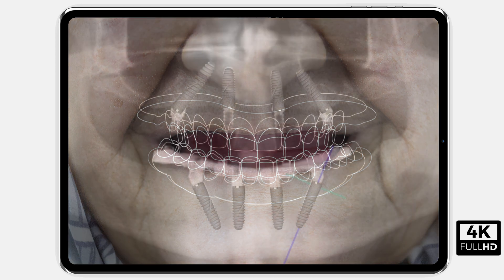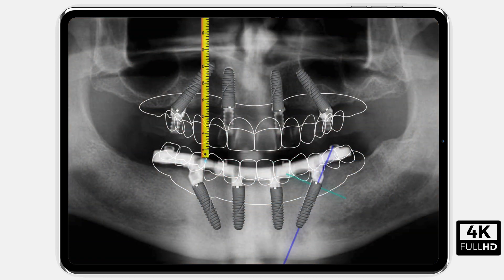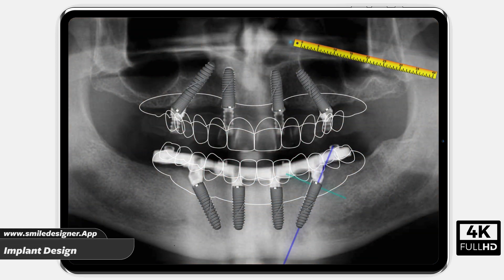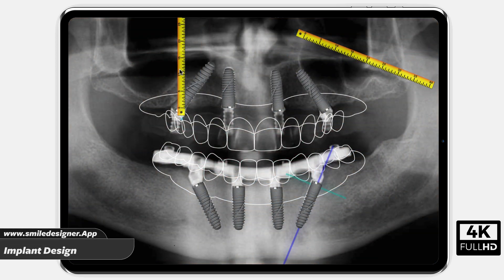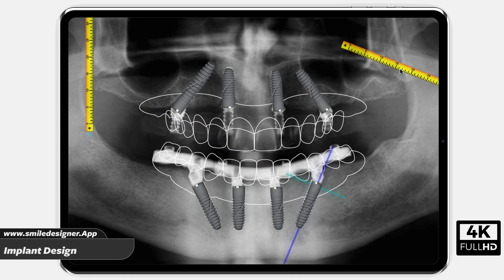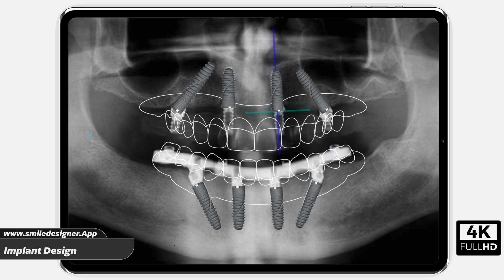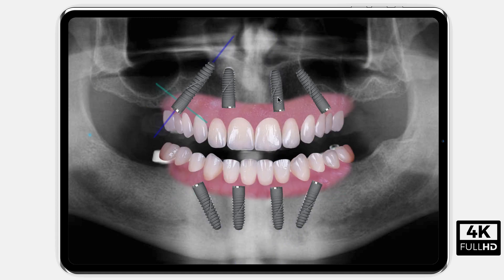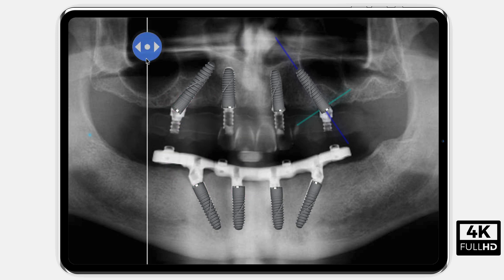Panoramic and tomographic images can be calibrated. Implant integration design and its measurement. All-on-4 and all-on-6 designs can be performed.